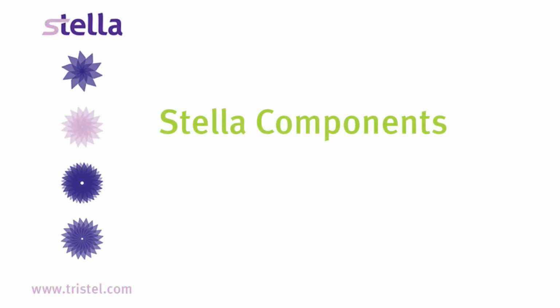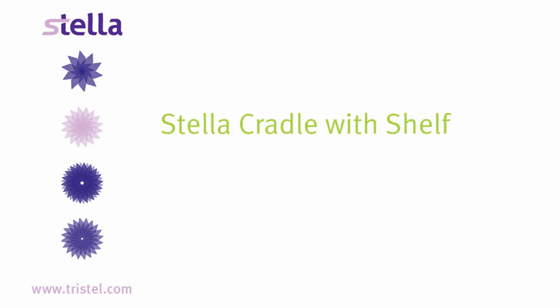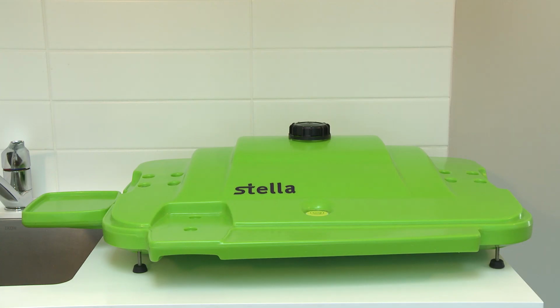Stella Components. To start, we are going to review the components that make up the Stella disinfection system. Stella Cradle with Shelf. This is the Stella Cradle and Shelf. Stella Cradle provides central storage for the Stella equipment and can be leveled. The disinfection cycle will not start automatically unless the Stella electronics detect the correct level measure of disinfectant.